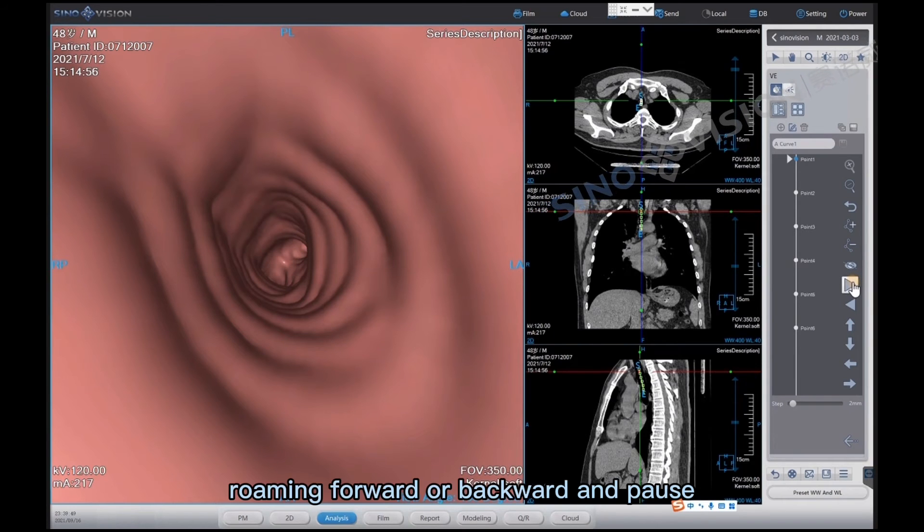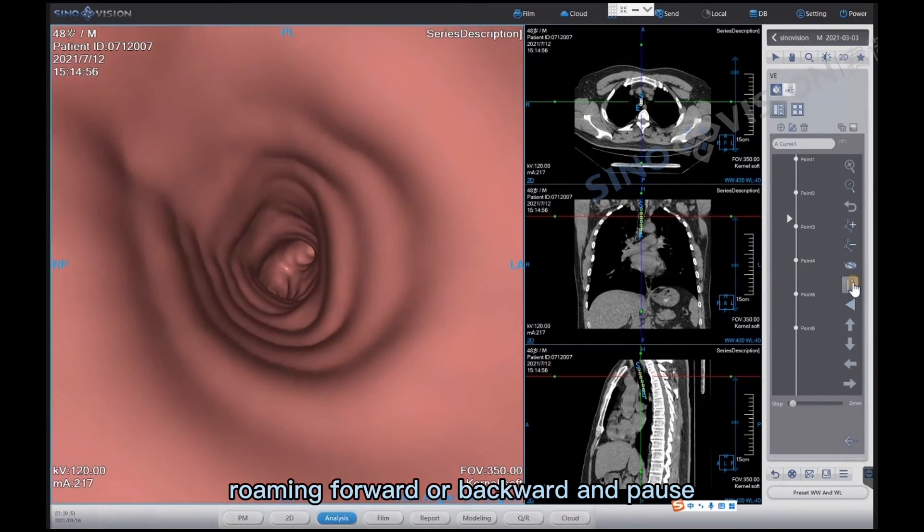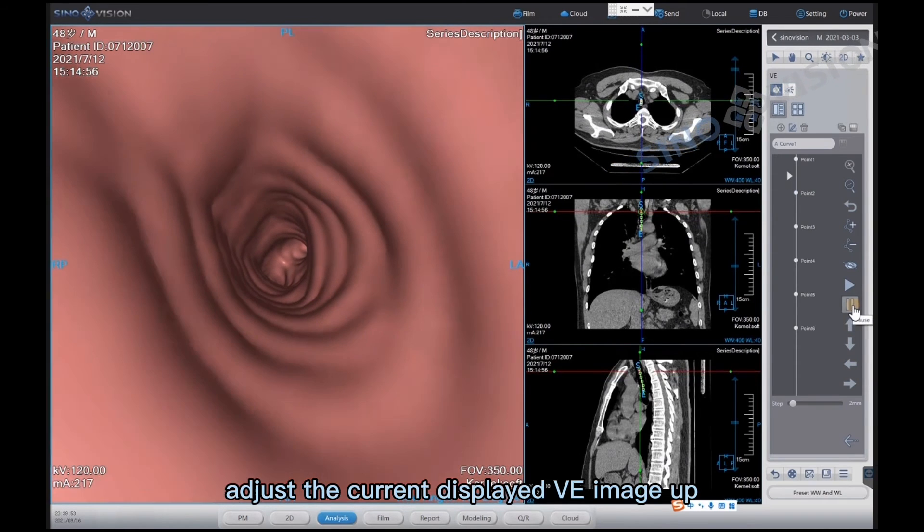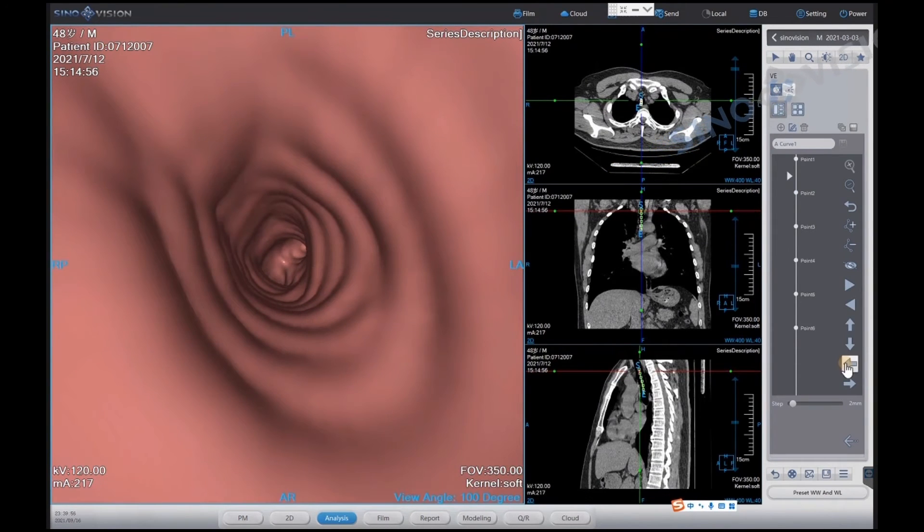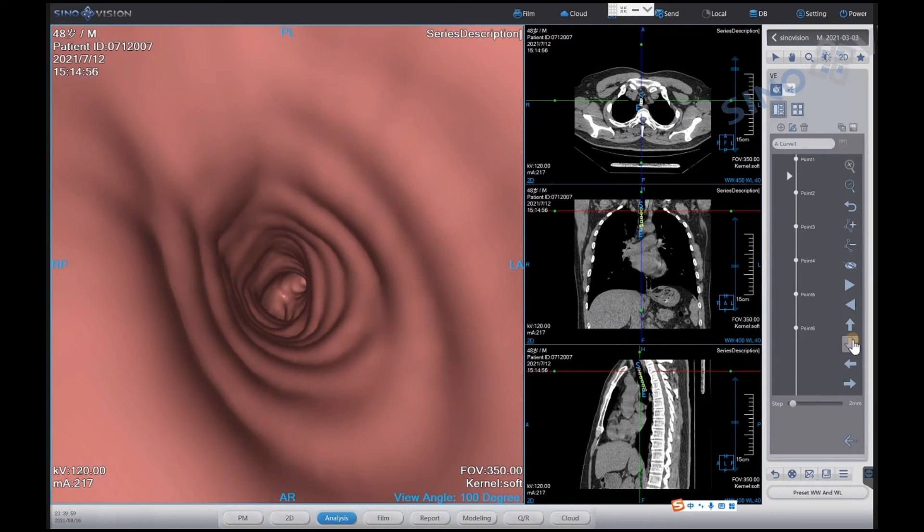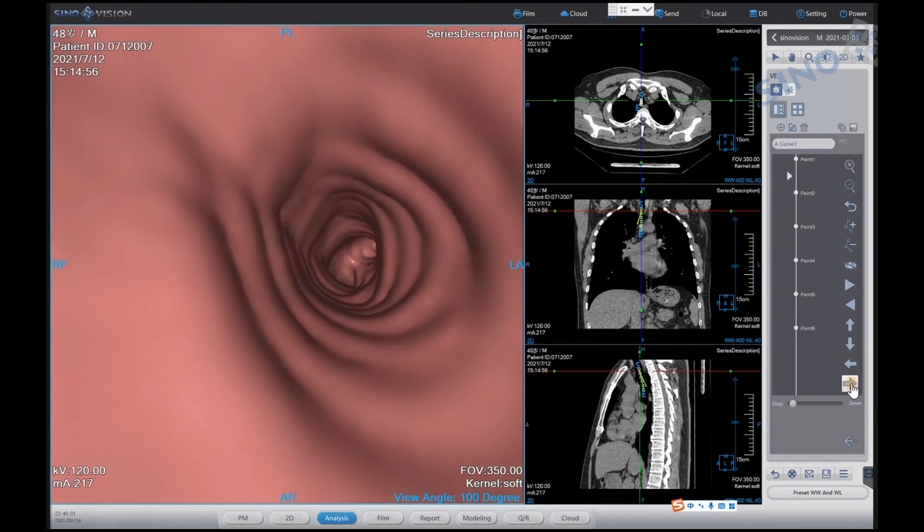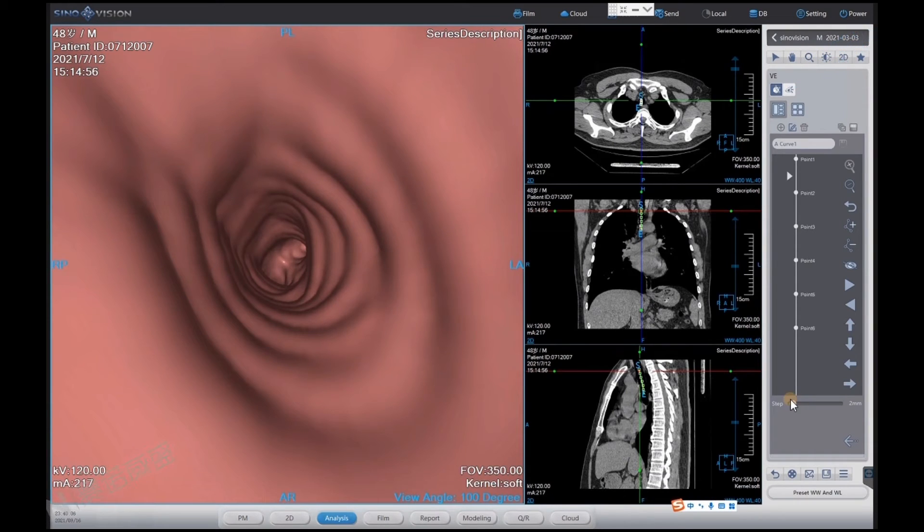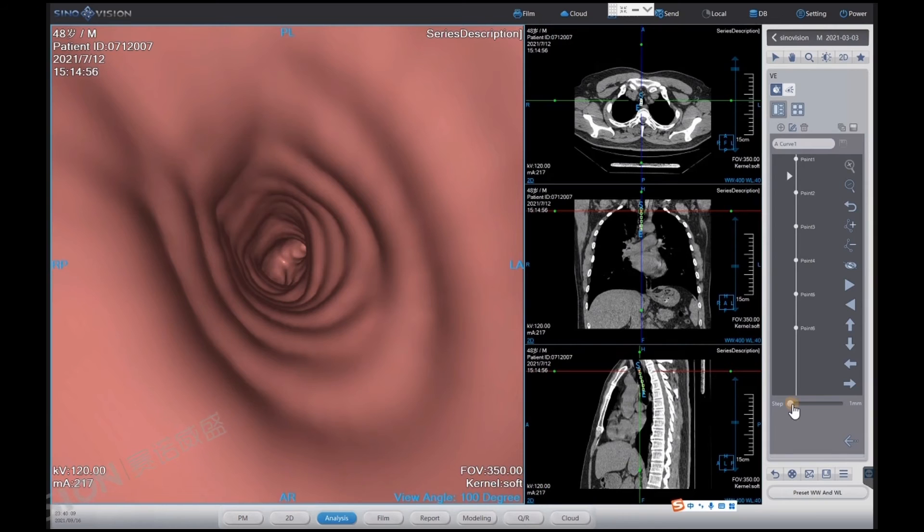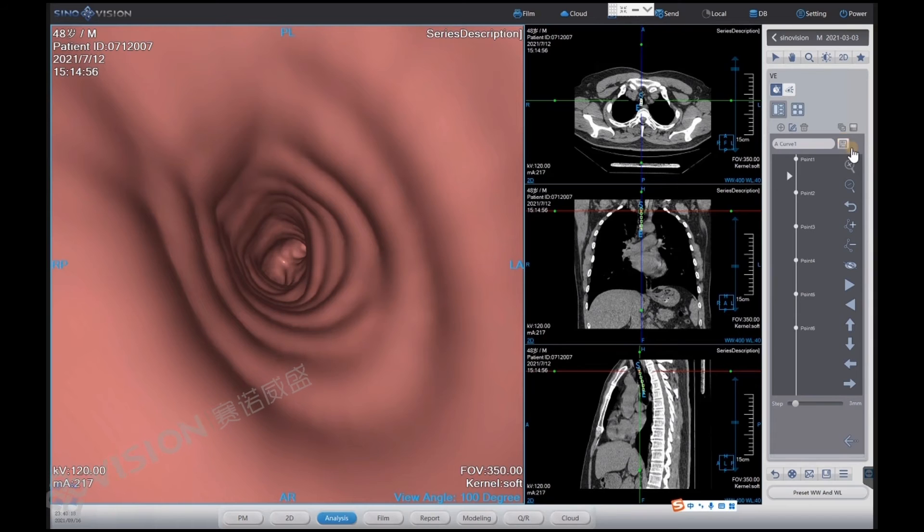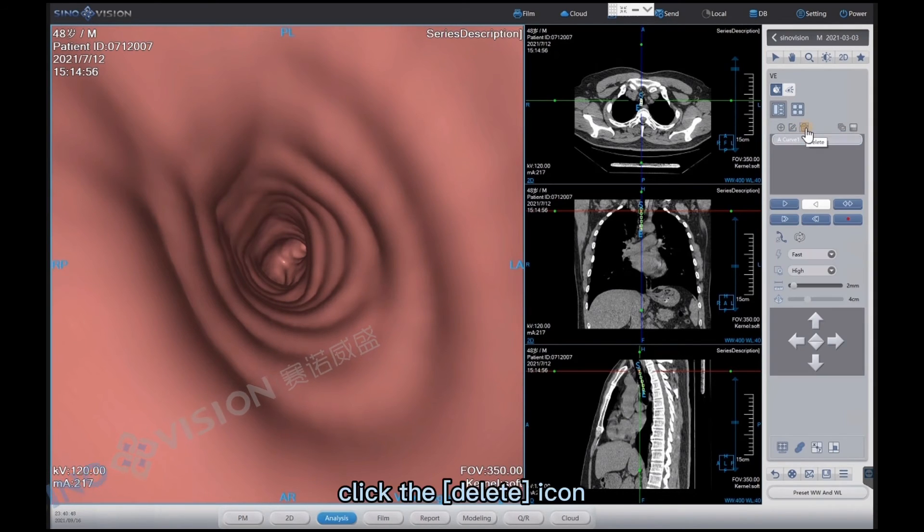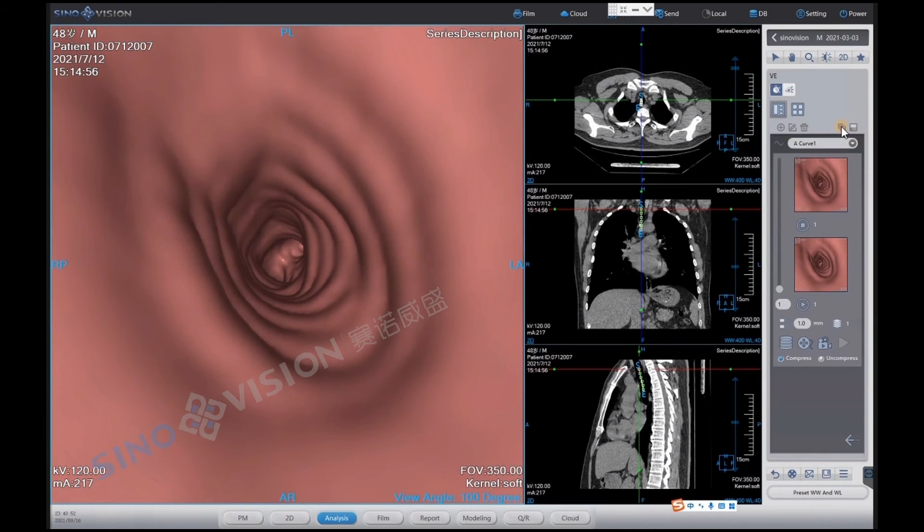Roaming forward or backward and pause. Adjust the current displayed VE image up, down, left, and right. The step length can be adjusted from 1 to 20 millimeters. After the adjustment is complete, click save at the top to save the adjusted path.